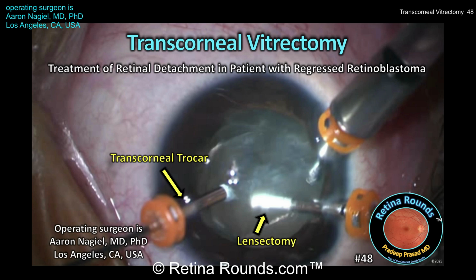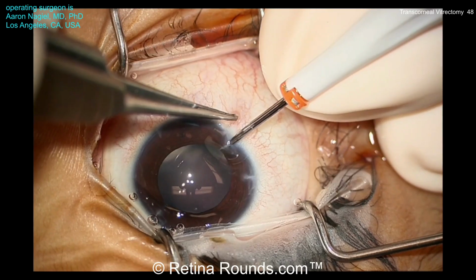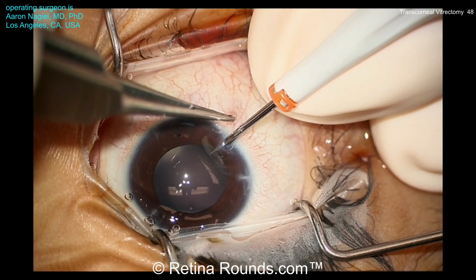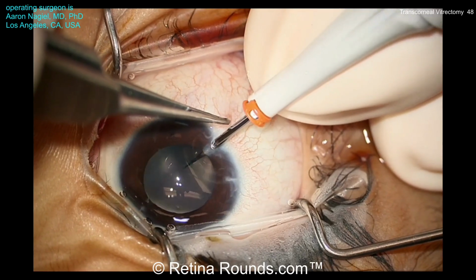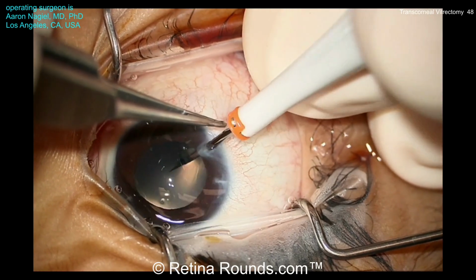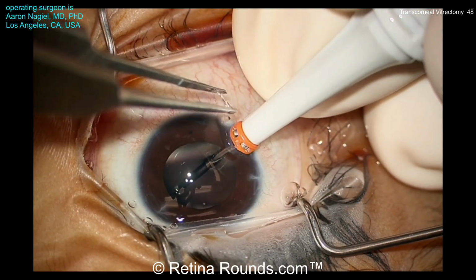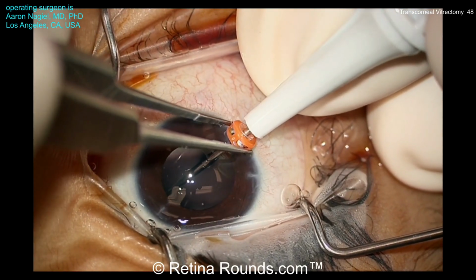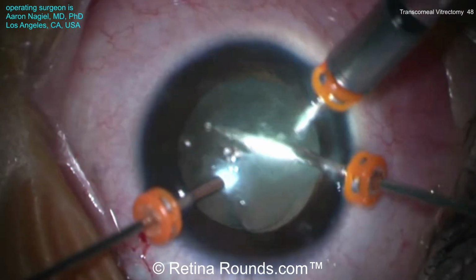First, we'll show you a video from another patient demonstrating transcorneal trocar placement. We're showing this to you at half speed. Here, a radial approach is taken with the trocar placement. You can see that a 23 gauge trocar is being placed proximal to the limbus in a radial fashion, and a twisting motion is used to allow the trocar to gain entry into the anterior chamber. Then the stiletto is removed and 2 additional trocars can be placed.